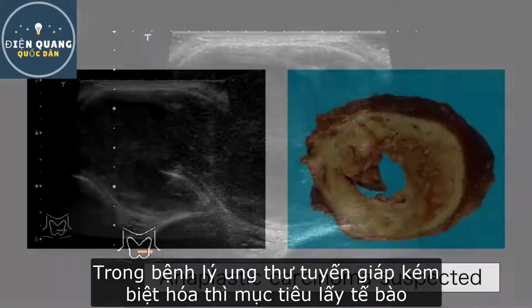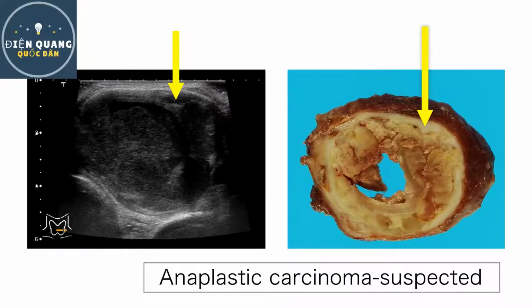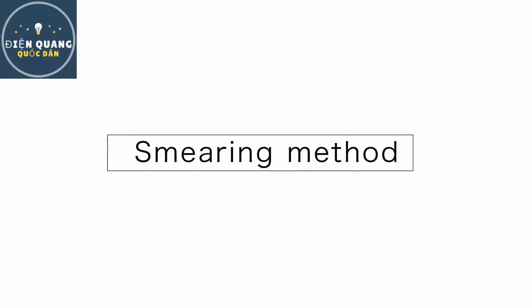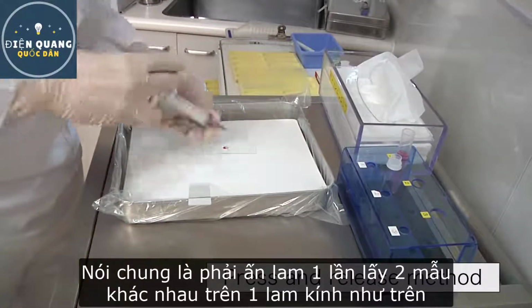When anaplastic carcinoma is suspected, the target is the nodule periphery. This is because anaplastic carcinomas tend to be massively necrotic. Now we would like to explain the smearing methods. Generally, we press twice the samples using another glass slide.